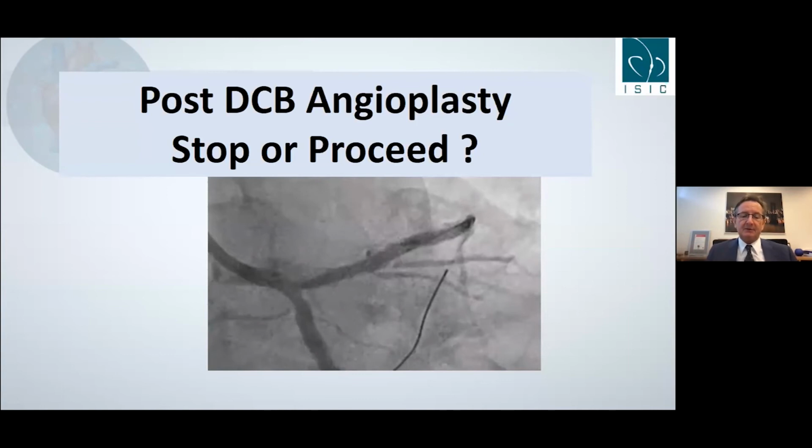This will be the first option. The second option will be to go from left main to LAD, and then POT, and then recross the circ and practically do the first kissing, and then take a look at how it looks. If the circ ostium looks okay, you could leave it like in our ABC study. Then you have only one additional stent from left main to LAD.